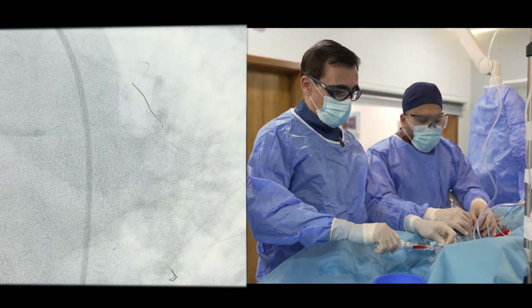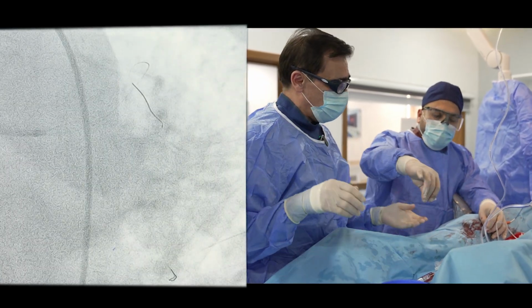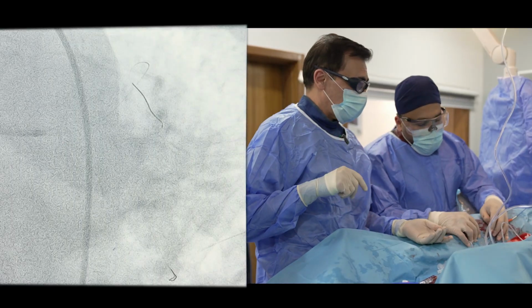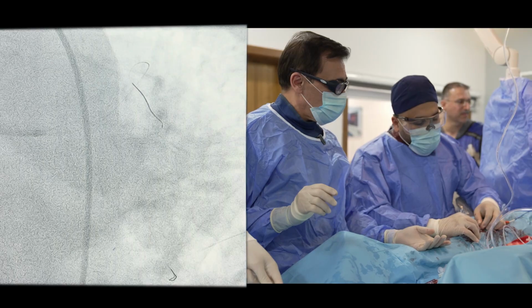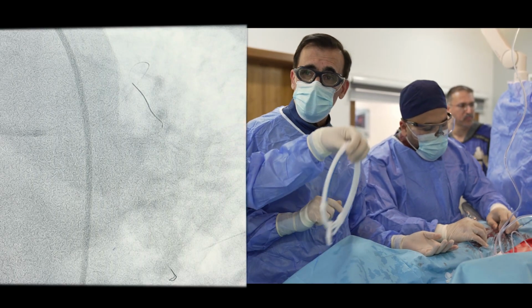We'll take. I think we need to make some way for the IVUS. So we are going to take a balloon 2.5 20 for the LAD left main stem, and then take the IVUS.